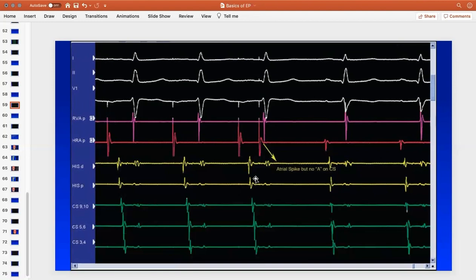Okay? So don't jump to conclusions. I know you can get fooled, but you know that this has to be a V, there is no A.